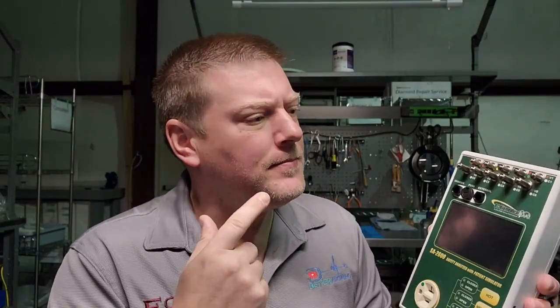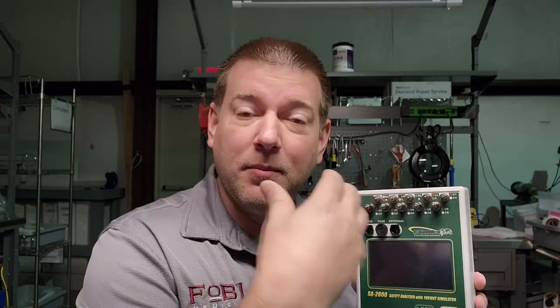I finally have it — I've been trying to get this for quite a while, but here it is: the SA 2600. Here's the thing: this isn't my first time making this video. I already recorded it once, and in doing so I found some real opportunities to improve it and make it a perfect biomed tool. So I took those concerns to the guys at BC Group, and believe it or not, they implemented them. This is the final product — let's check it out.